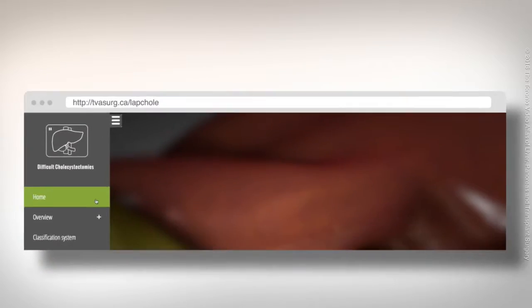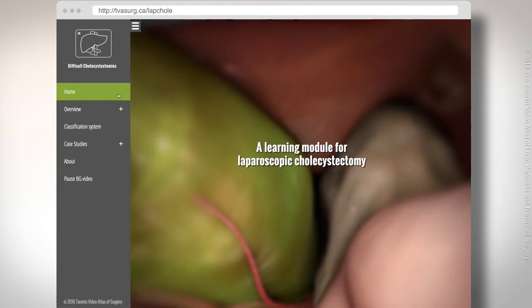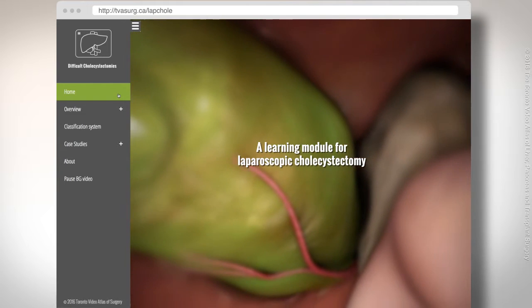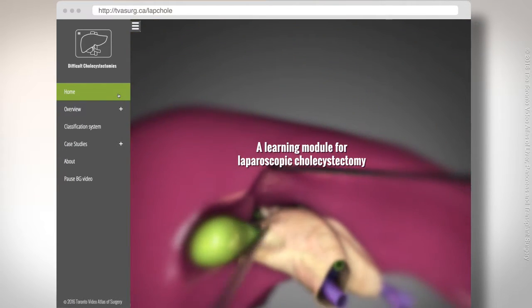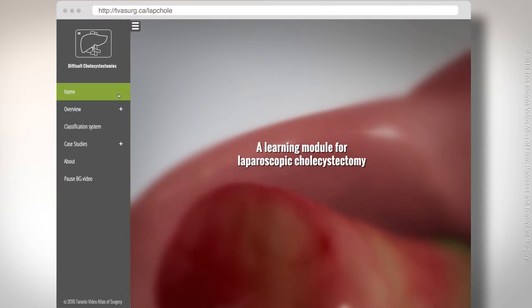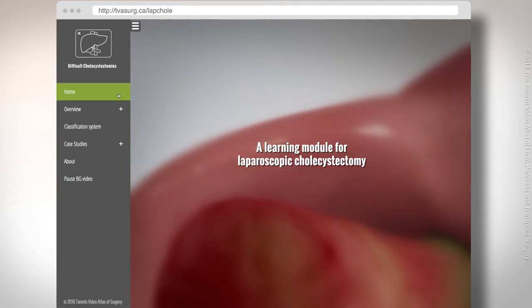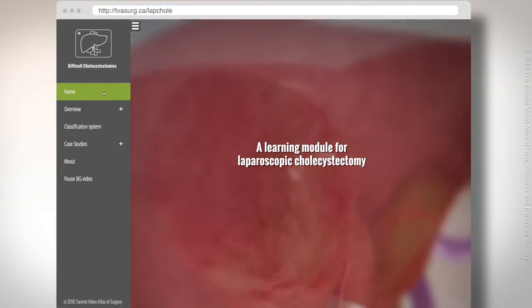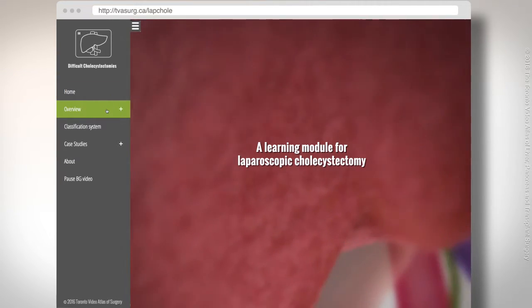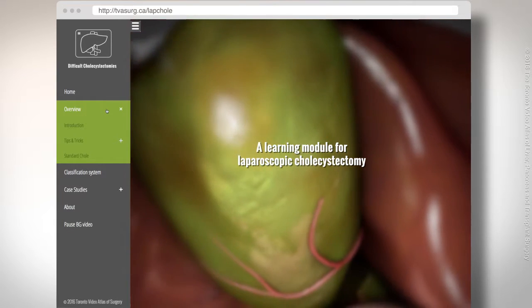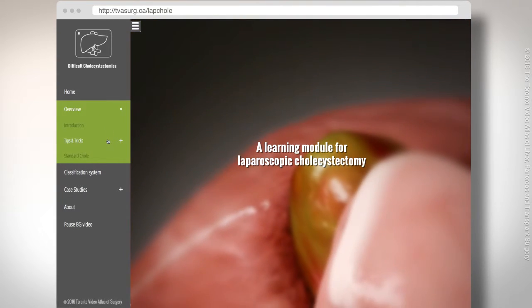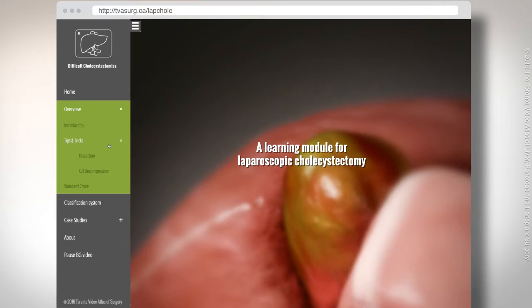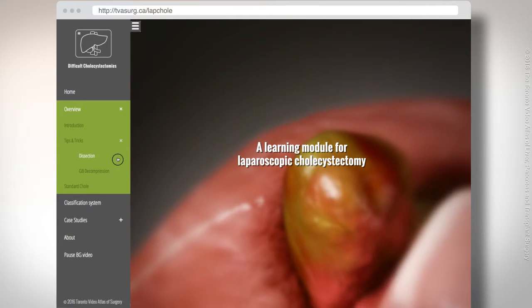This video demonstrates a learning module for laparoscopic cholecystectomy developed at the University of Toronto. The intention of the learning module is to demonstrate safe techniques in performing laparoscopic cholecystectomies for both routine and difficult cases. We have modules on tips and tricks for dissection in the face of inflammation and complex anatomy.